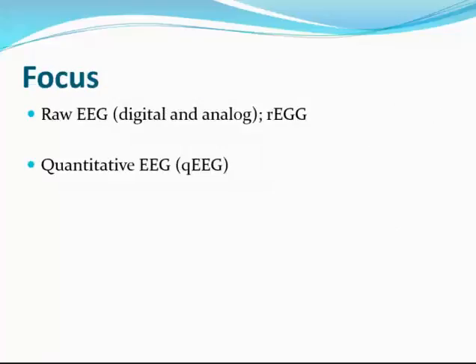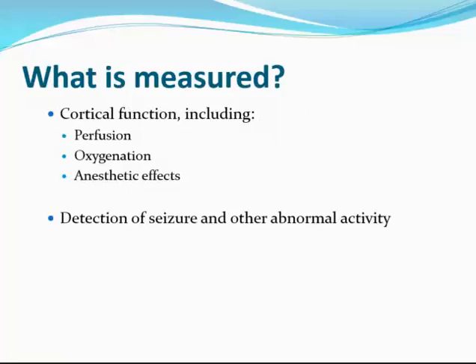And our focus is going to be raw EEG. We may touch here and there on quantitative EEG, but our main focus is on the raw EEG as it comes in. What are we measuring when we're talking about EEG?